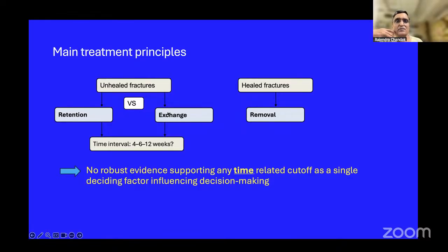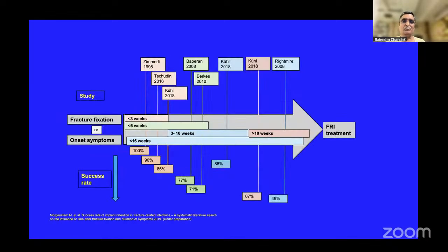And if this happens over a period of time beyond, say, 6 to 12 weeks, or once it is established and bone lysis has occurred, then it would be removal of the implant, then antibiotic coated nail, and in second phase, bone grafting and fixation, etc. If the infection happens after a healed fracture, then of course, removal of the implant and other measures are required.